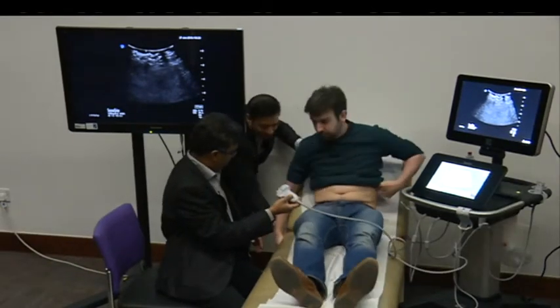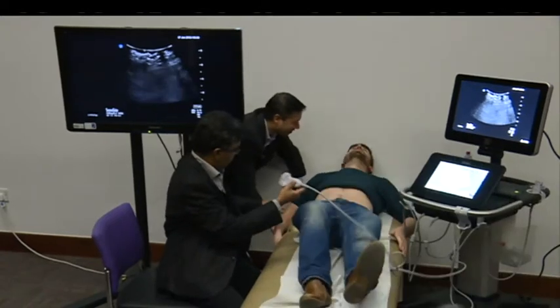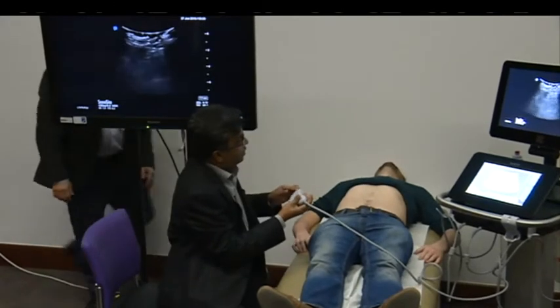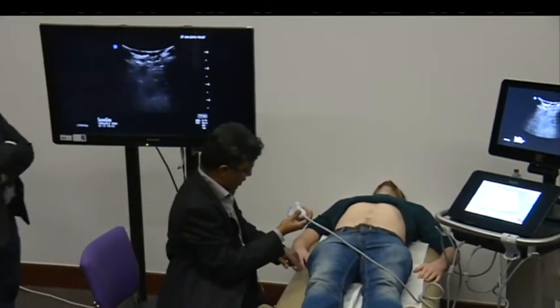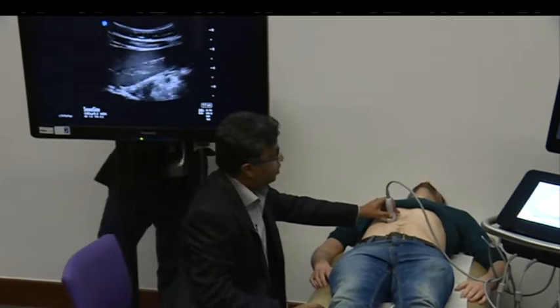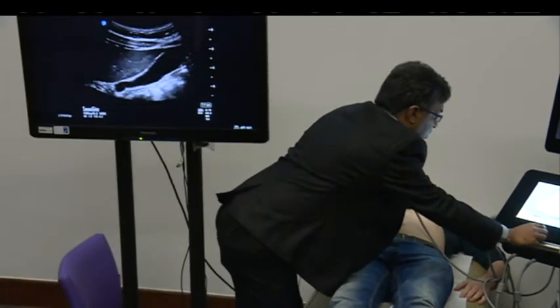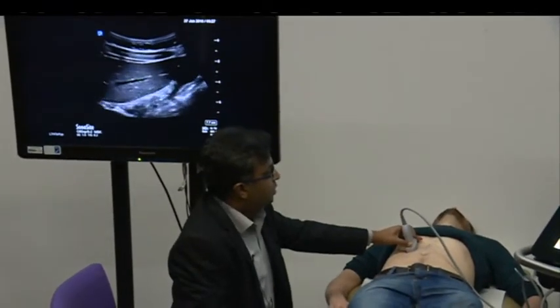You either go supine or right lateral decubitus. So the logo is the head end. You put your probe in just in the right hypochondrium. All you are interested in - we need to increase the depth - keep going.